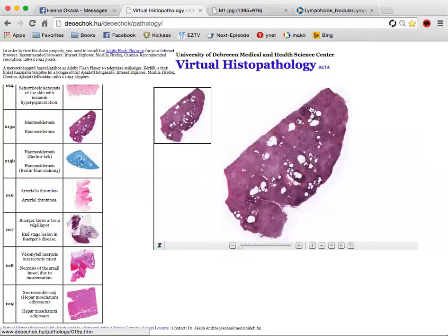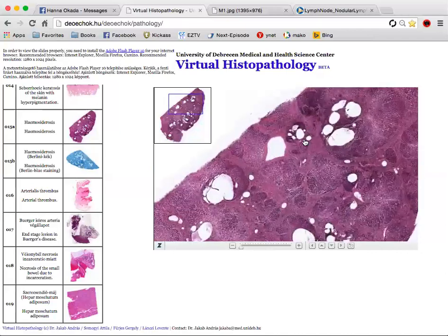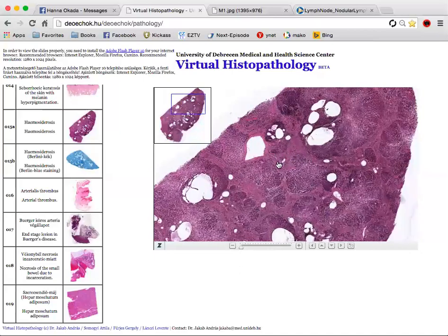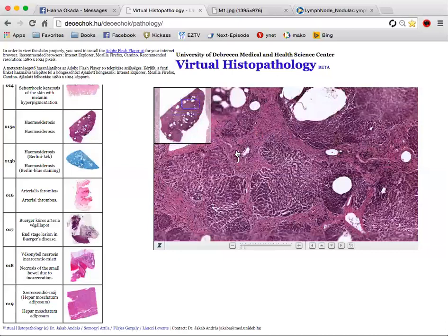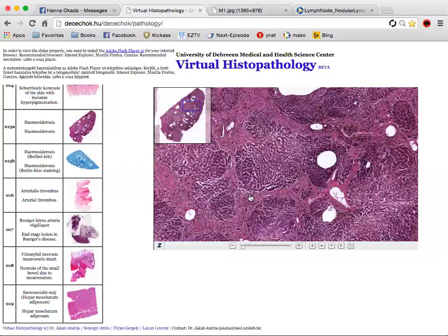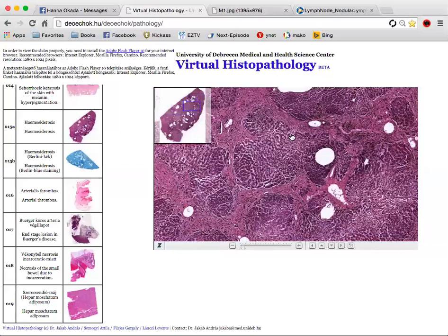So this is a specimen of liver. This one is in H&E, and the next one would be in Prussian blue. I'm going to zoom in, and what you can see is this is liver tissue. Do you see all this connective tissue? So there's actually liver fibrosis here. This is all fibrous connective tissue. If it continues, there might be cirrhosis, and this is more for next semester. So this is just fibrosis. With cirrhosis, you also need regeneration.